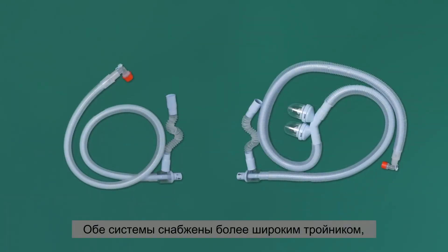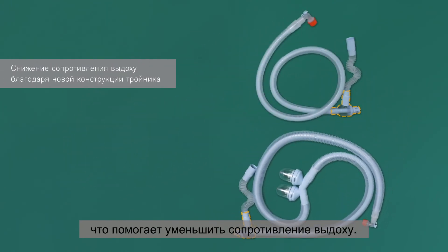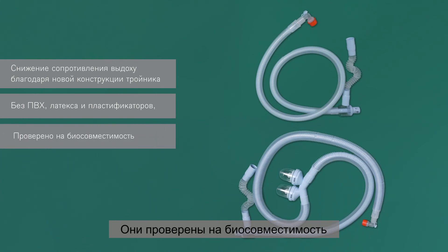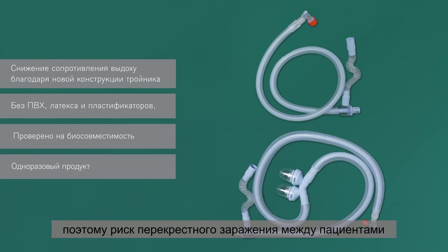Both systems incorporate a T-piece in a new, wider design that helps reduce the expiratory resistance. They are PVC and latex-free and produced without added plasticizers like DEHP. They have been tested for biocompatibility and are resistant against anesthetic gas. Both products are designed for single use so that the risk of cross-contamination between patients via the breathing hose is practically non-existent.